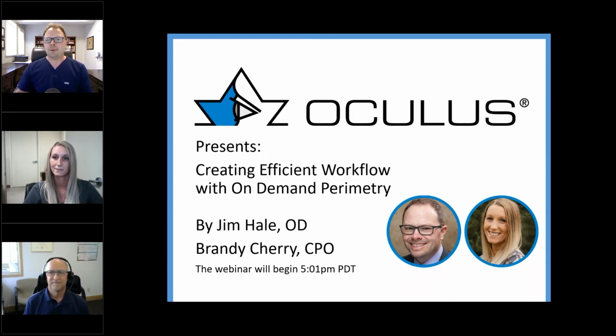So the first thing I wanted to bring up and describe was just how we did this process before. Before on-demand perimetry, we used the typical optometric model where we would identify a potential problem during a comprehensive vision exam. We would schedule that patient to return to the clinic for diagnostic testing. At that point, we were using an industry standard visual field unit.